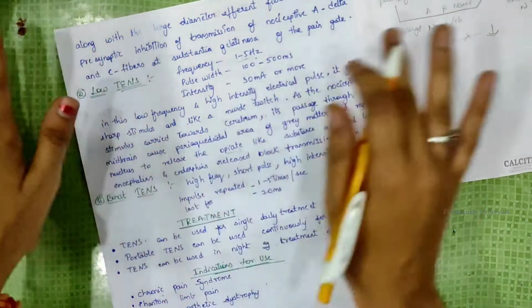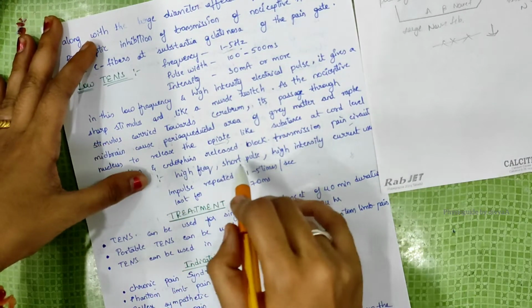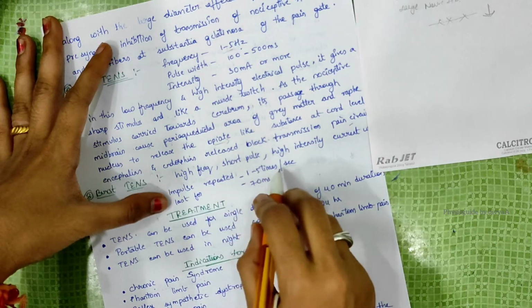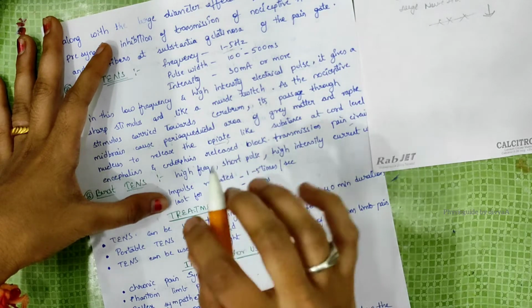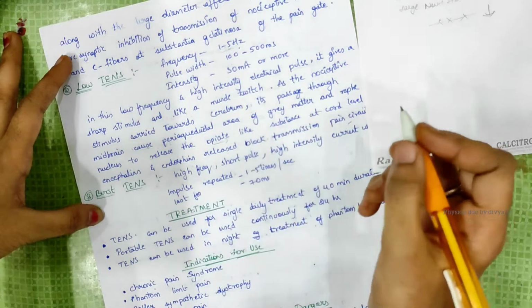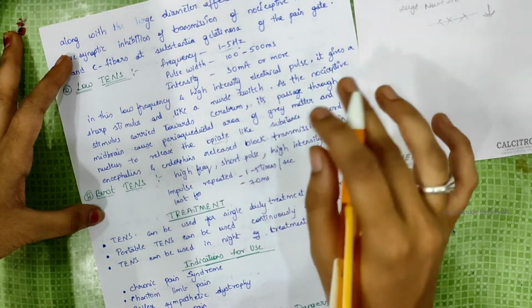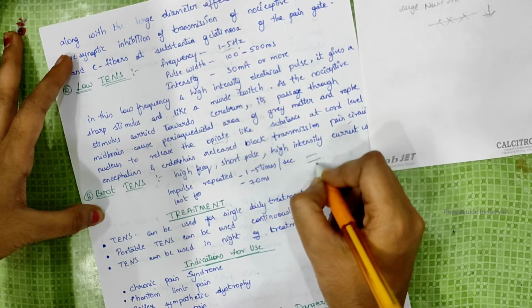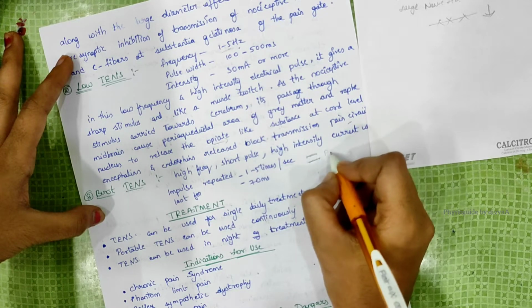Okay, by this stimulation. Burst TENS means high frequency, short pulse, high intensity current is used in pulses of 1 to 5 times per second, each lasting 70 ms. The benefit of Burst TENS is that it combines both conventional and acupuncture-like TENS, and thus provides pain relief by both routes, acupuncture and conventional. Pain relief is felt.